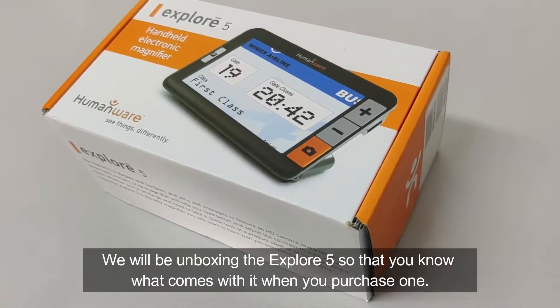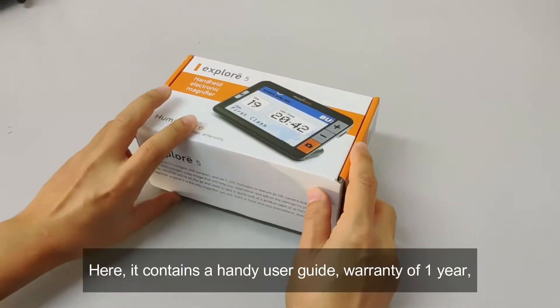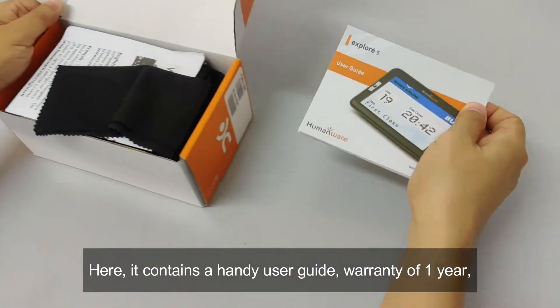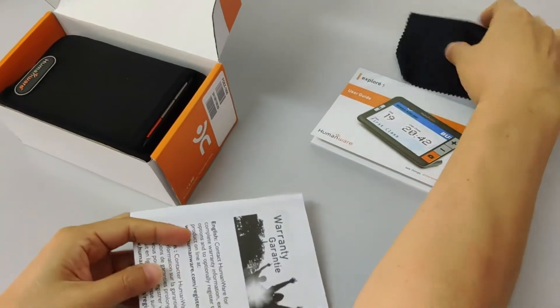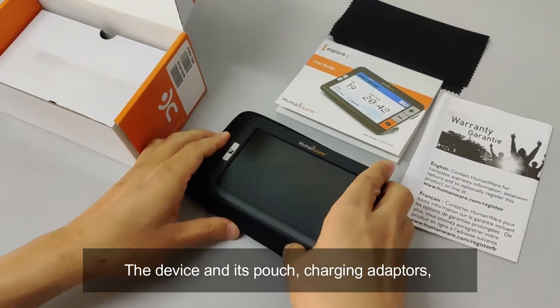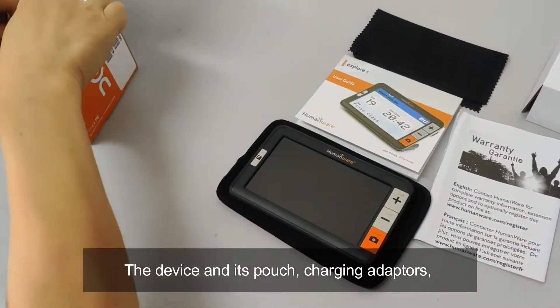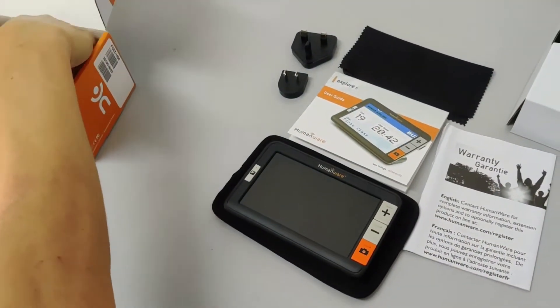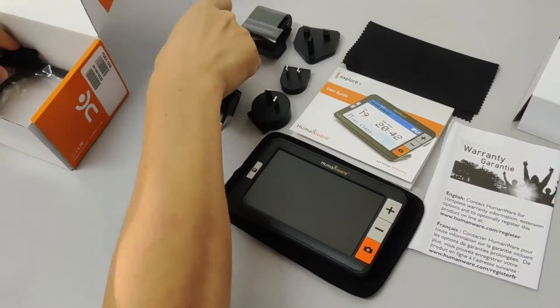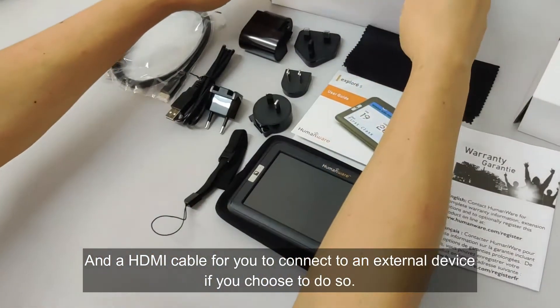We'll be unboxing the Explore 5 so that you know what comes with it when you purchase one. It contains a handy user guide, a warranty of one year, the device and its pouch, charging adapters, and an HDMI cable for you to connect to an external device if you choose to do so.